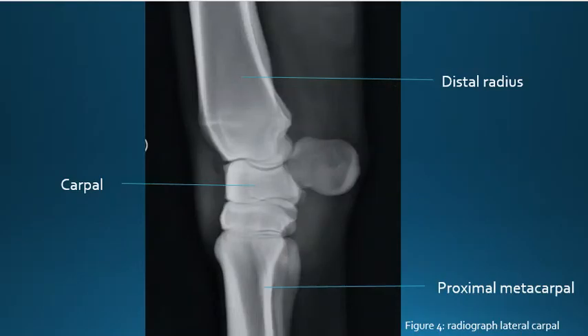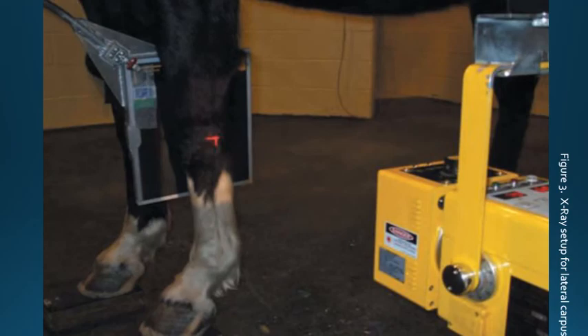The image should include the distal half of the radius, the proximal half of the metacarpal, as well as the full carpal joint. The plate should be against the horse's leg and parallel, with the center beam going through the carpal joint and the label in the cranial rostral corner of the image.